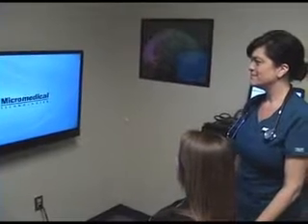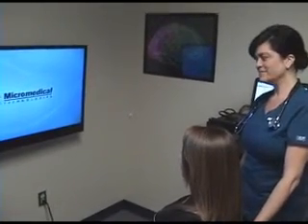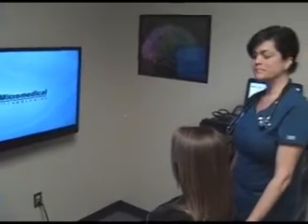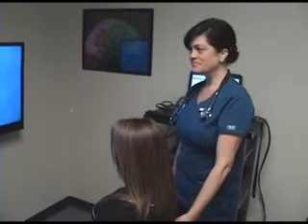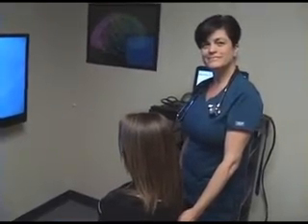So what I'd like to do on this section of the video is do a demonstration of what a VNG test, or a video nystagmographic test, would look like and how we do it in our office. I'm here with Donna and one of our patients. Donna is one of our VNG techs, and today she's going to demonstrate how the VNG is performed. So Donna, if you don't mind, show us the goggles if you would.